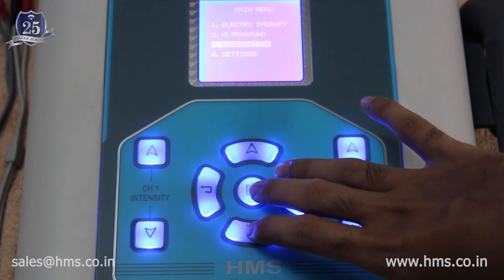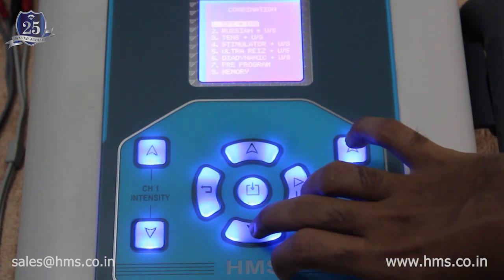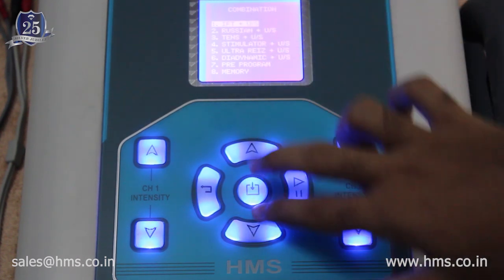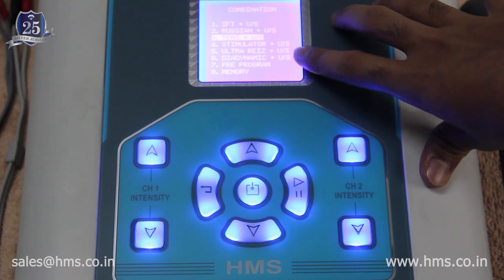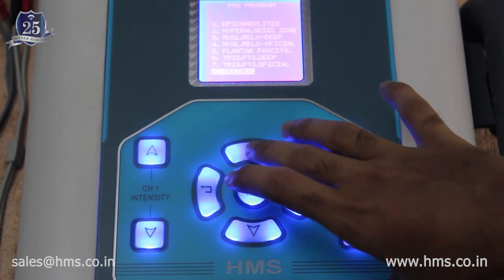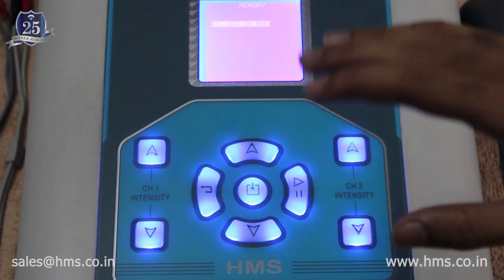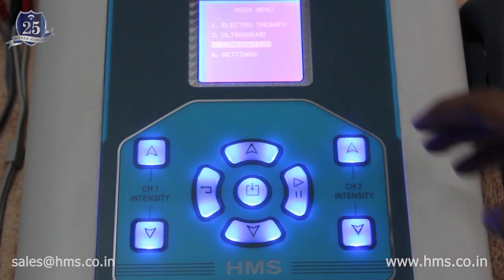In combination therapy, all six electrotherapy modalities can be combined with ultrasound — for example, IFT plus ultrasound, Russian plus ultrasound, or TENS plus ultrasound. There are eight pre-programs for combination therapy, and it has 30 individual memory settings as well. In total, the machine can store 90 different memory settings across electrotherapy, ultrasound, and combination therapy.